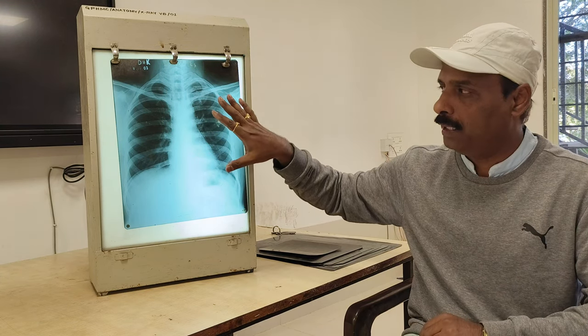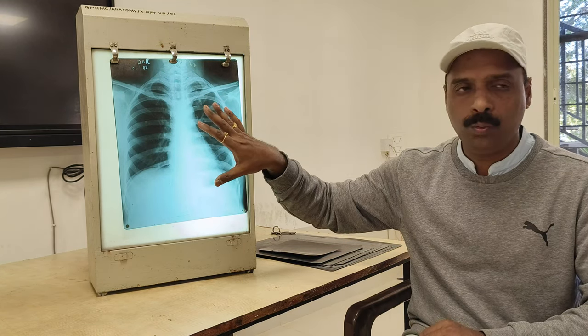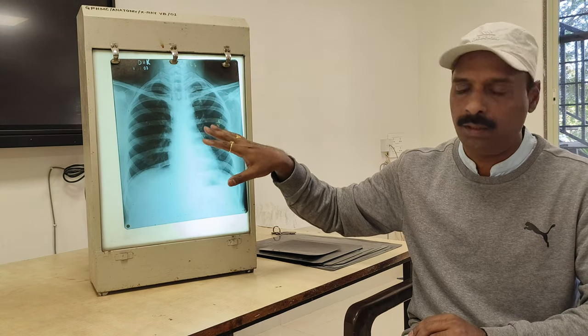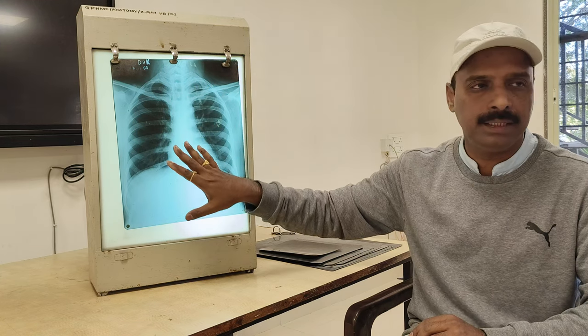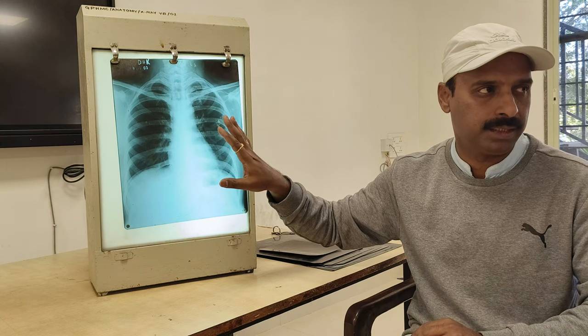Next you have to learn how to read the x-rays. I have told you, when you want to visualize the anterior structures of the body, we take a PA chest. We want to visualize the heart and lungs anteriorly. So we pass the rays from behind to front, and the front structures are seen better. That is what we call a PA chest.